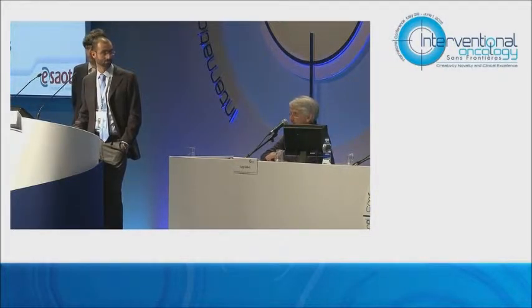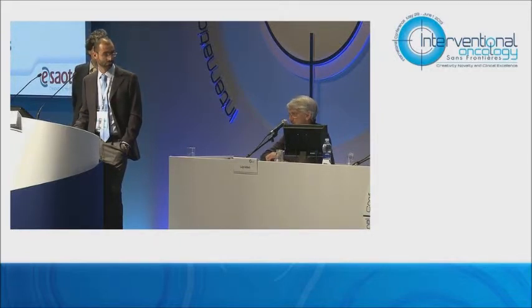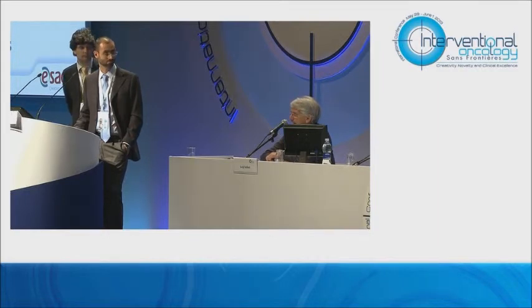And everyone who performs interventional procedures like these treatments knows that local retreatment is always more complex than the initial treatment. So it's crucial to achieve as much as possible with the first treatment and possibly avoid a local retreatment. This is also important for the situation of the patient, because you have to explain to the patient that the treatment was not complete and he should undergo a new ablation.